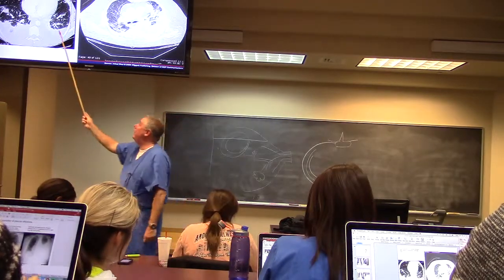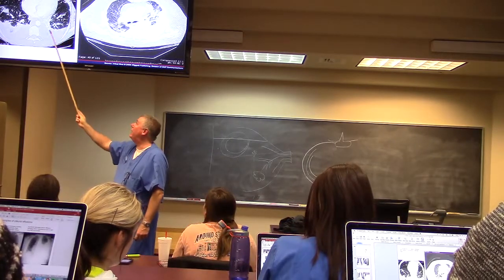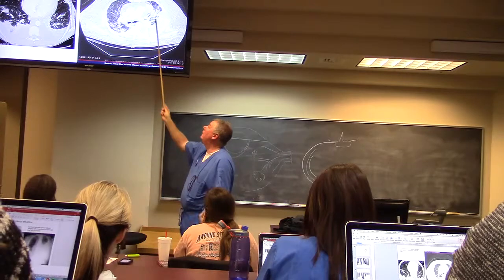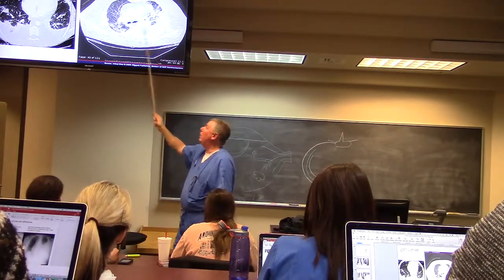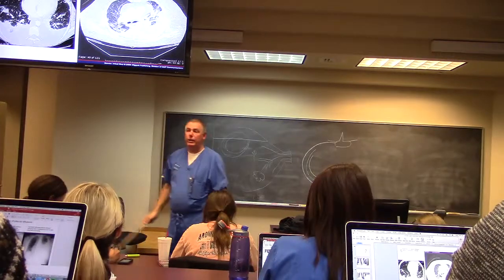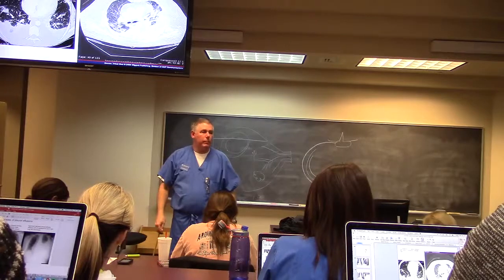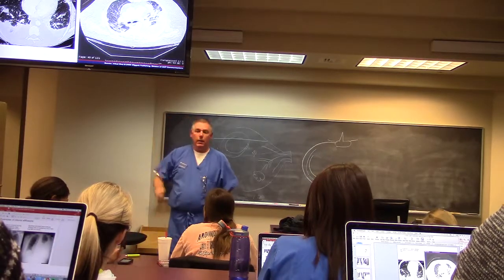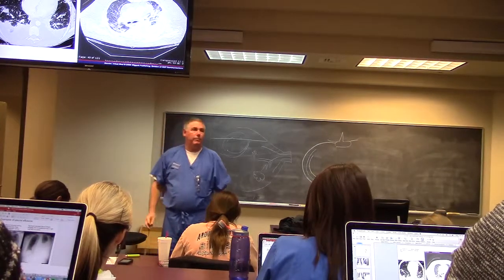Over here on this side, it's around the lung. It's pooled at the back. Over here on this one, it's in the lung. This is an infiltrate. This is like pneumonia, where that's a pleural effusion. If you're gonna tap that pleural effusion, where do you stick the needle? At the top of a rib, superior surface of the rib.